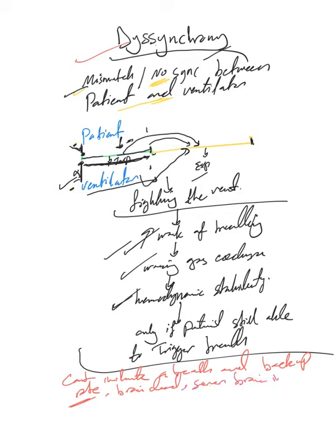severe brain injury or deep sedation or paralyzed patients. All these patients are dependent on the ventilator and the backup rate, because with only ventilator breaths delivered, we will not have any desynchronization. The desynchronization will happen only with patients who are triggering their own breath.